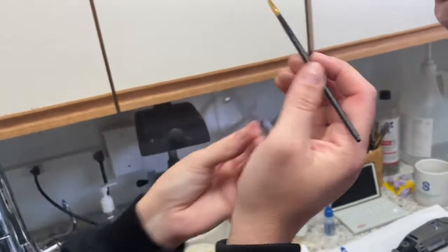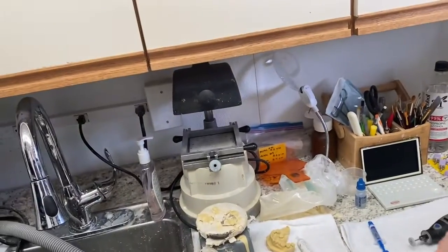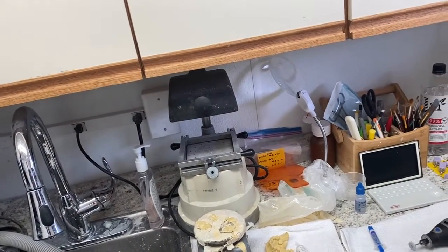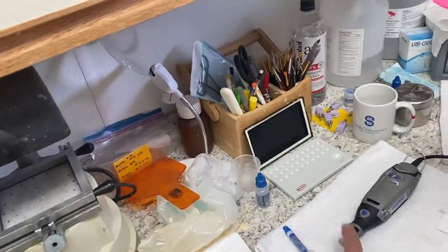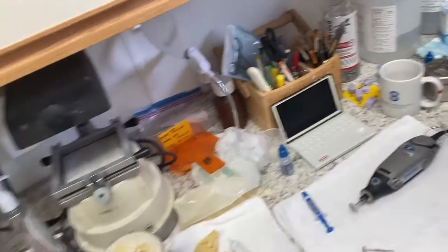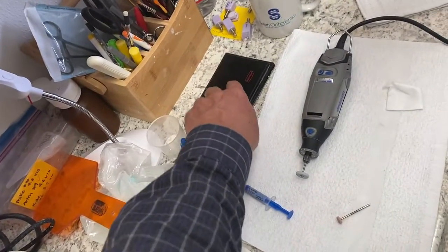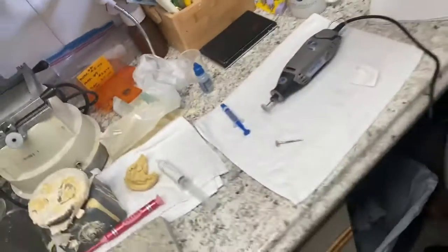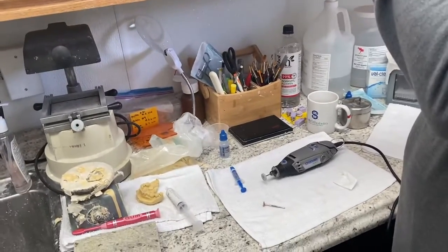Okay, so we're really concerned about the quality of the glaze, and so that cover only gets open when you're using the glaze, and it gets immediately covered. If you have this running with that cover open, that glaze will be ruined. Dirty. Yeah, so you've got to always put that cover on that glaze. That glaze has to be covered all the time. If in doubt about clean glaze, you just do new glaze.